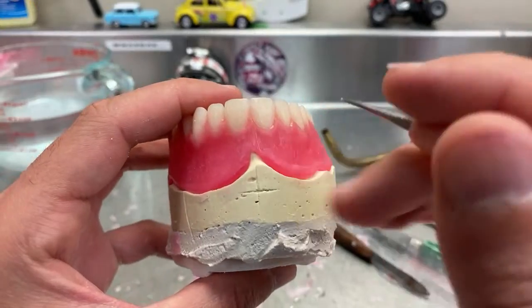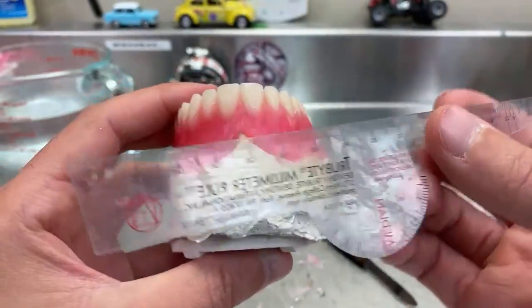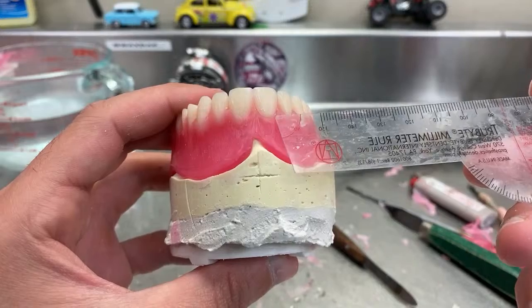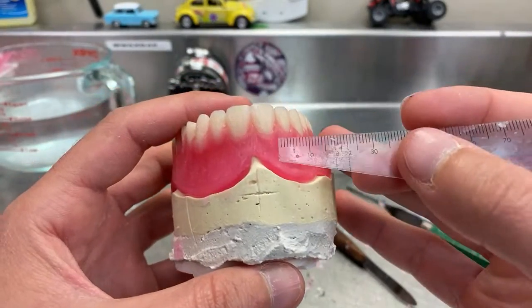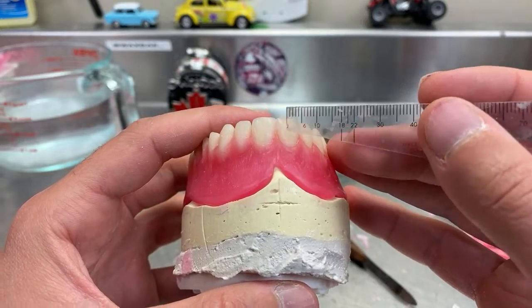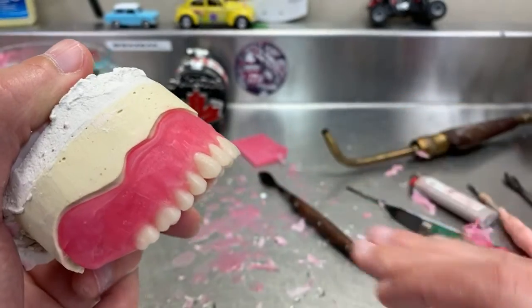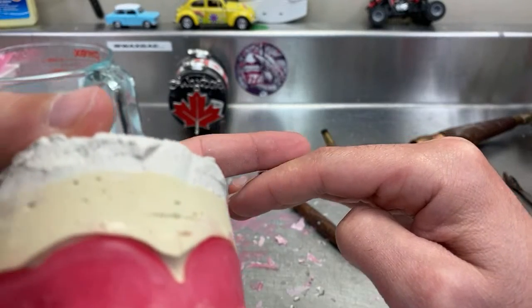So one thing to notice here that I always mention is when you're carving. So if you look at it in a straight line, you want your... So this patient is 75 years old. So of course you don't want to carve them too short, and they don't want a very overexposed tooth. So what you want to do is give them kind of above universal, just a little bit higher, which is right where the tooth starts to curve. I hope you can see it in the camera, but that tooth comes like that, and then before it turns into the root area, it kind of has a little divot like this. So you want it to be carved right before that.